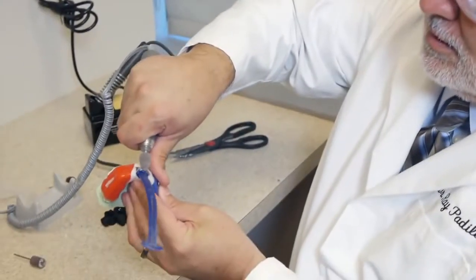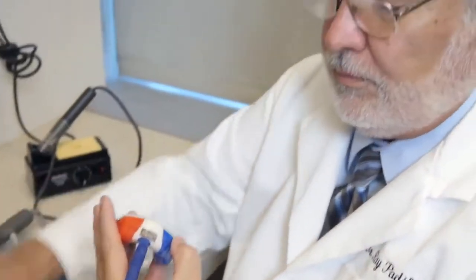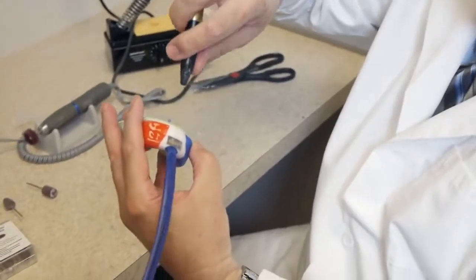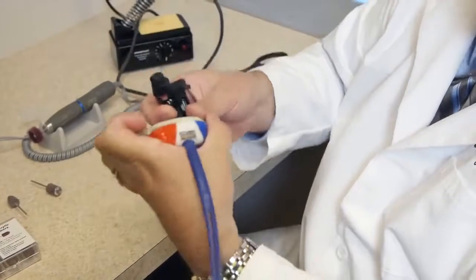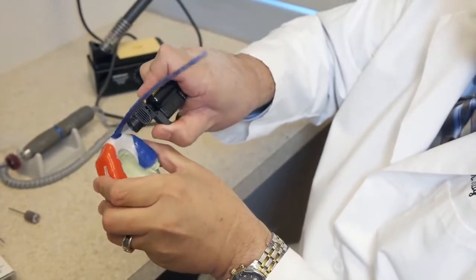Once the strap is cooled, you're going to go back to your stone acrylic burr. You're going to trim the excess. Now you'll just air blow it, get all the particles off. Place your final polish again. Let this cool back to room temperature. Now you have your strap. Again, the straps are not necessary. However, if they are required, they can be placed on pressure thermoformed mouth guards.